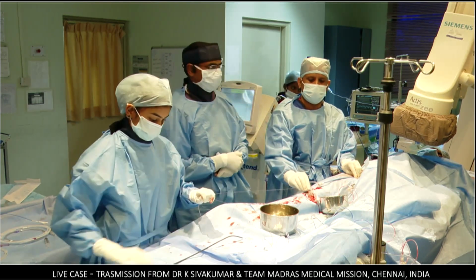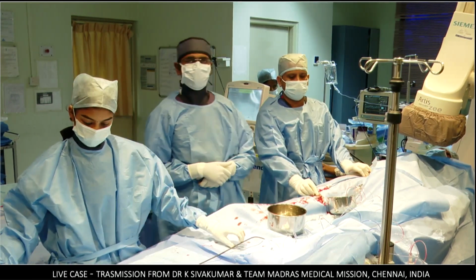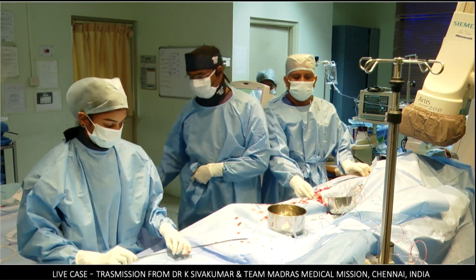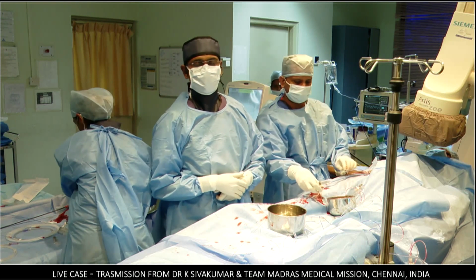Now I have with me Dr. Vishnu, who is my senior fellow, and Sister Ivarani, who is the scrub nurse. Dr. Srija Pavitran is the imaging person, and we are showing a new device called the HeartX device. After the initial PowerPoint presentation, I'll show the device, and then move further.